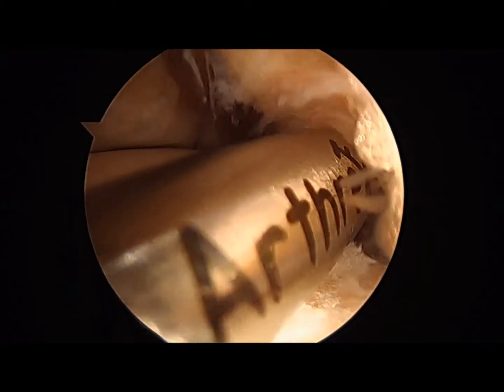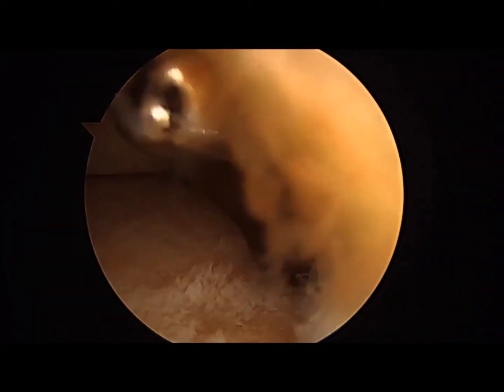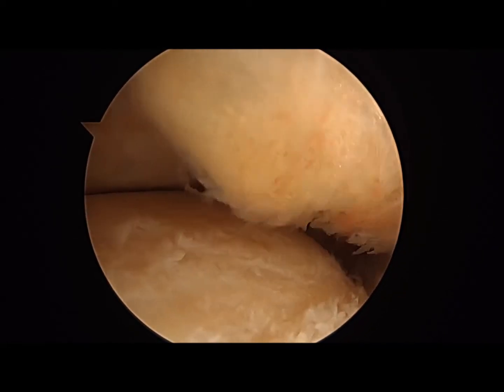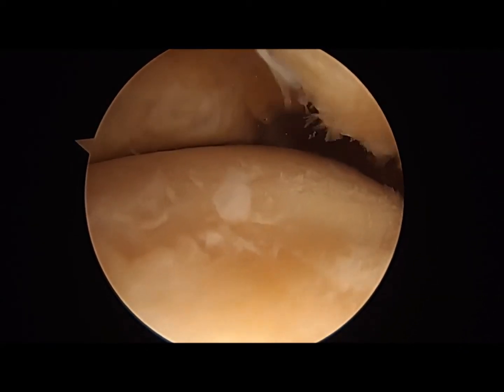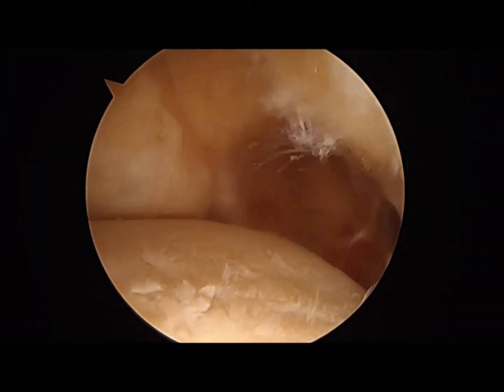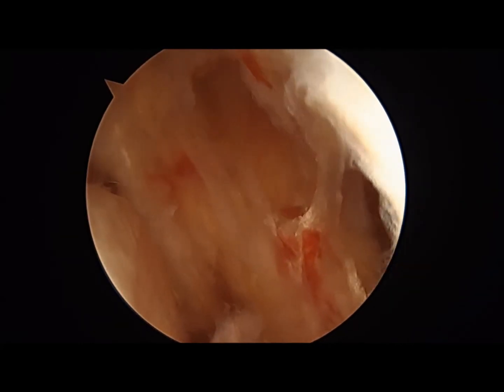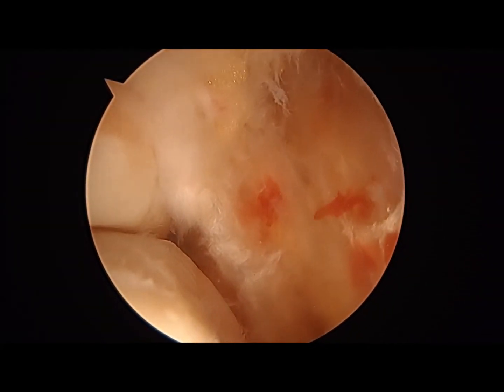Range of motion looks good. Again, we're going to inspect the gutter. Anterolateral gutter impingement is gone. Capture image.